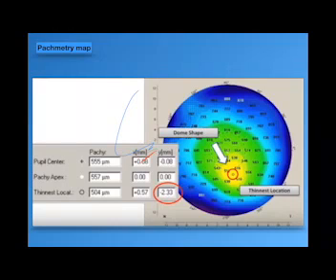So there are four factors: the difference between the elevation, the difference between the thickness, the steepest K, and so on. Otherwise normal eyes should be close to each other. It shouldn't exceed the accepted range, otherwise you will discuss.